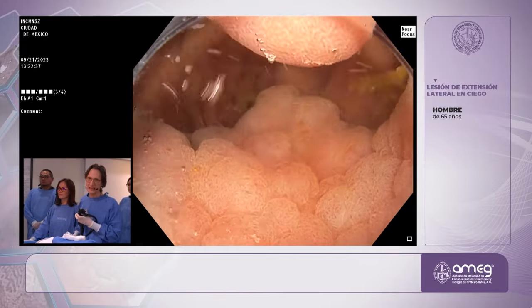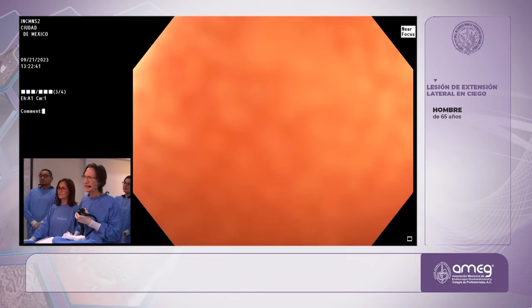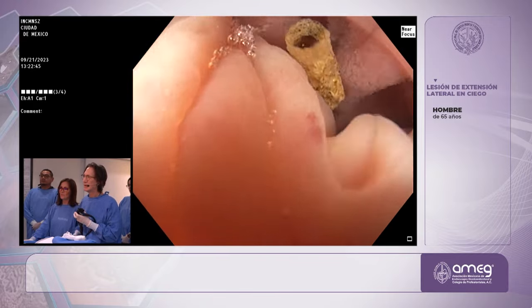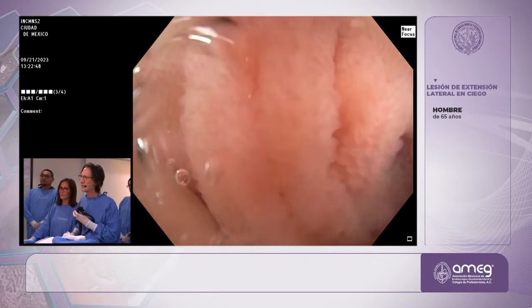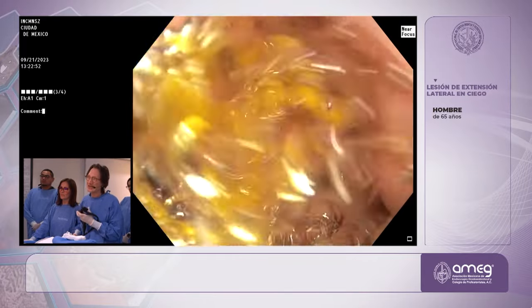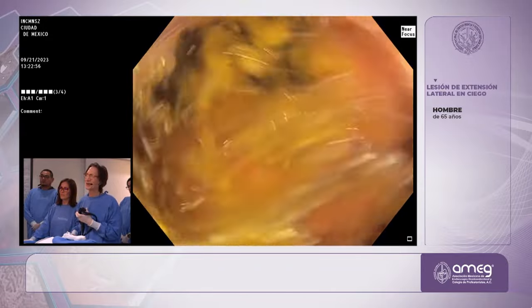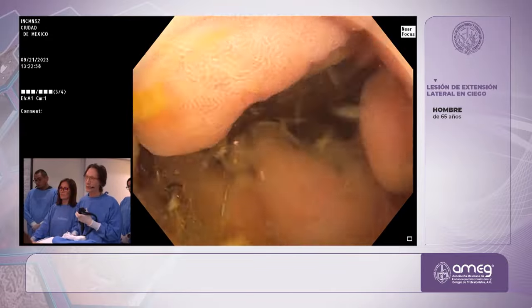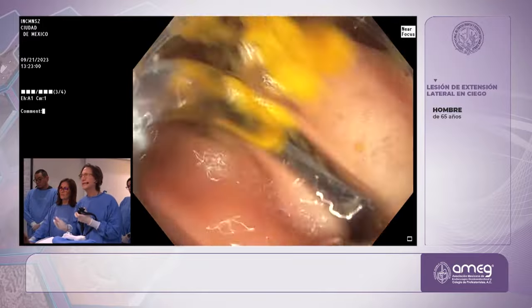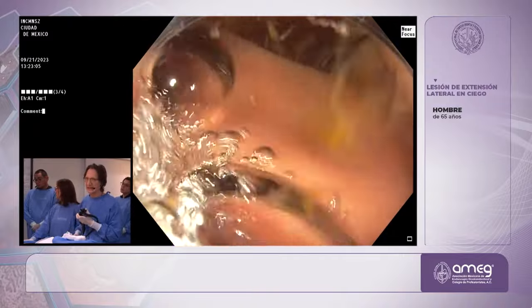And obviously, this is a 1S, 2A lesion, mostly 1S. So it is an elevated lesion. It's actually what we call sessile. There's a lot of, I have to get all these water air bubbles out here. So while I do that, I'll talk. So what we confuse now from earlier terminology is the term elevated and sessile.